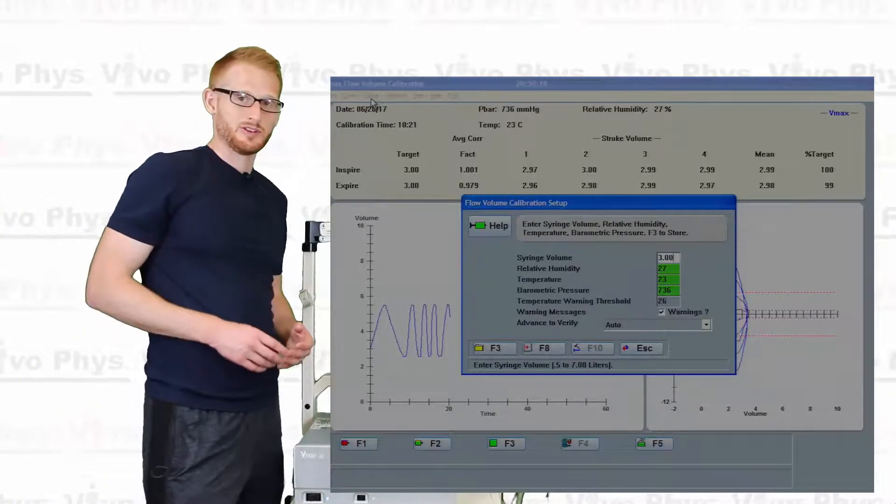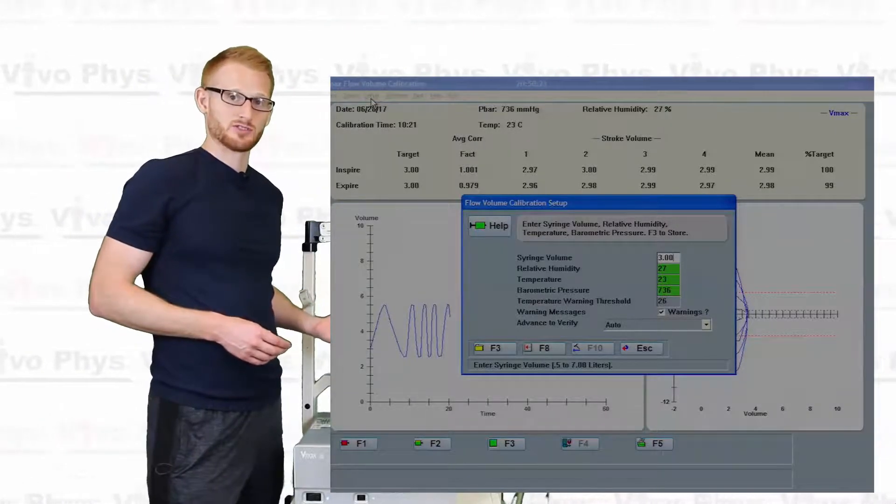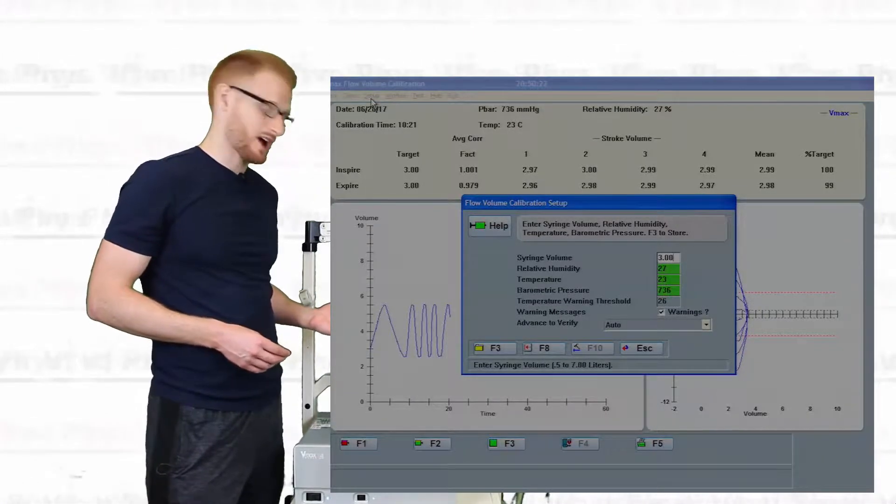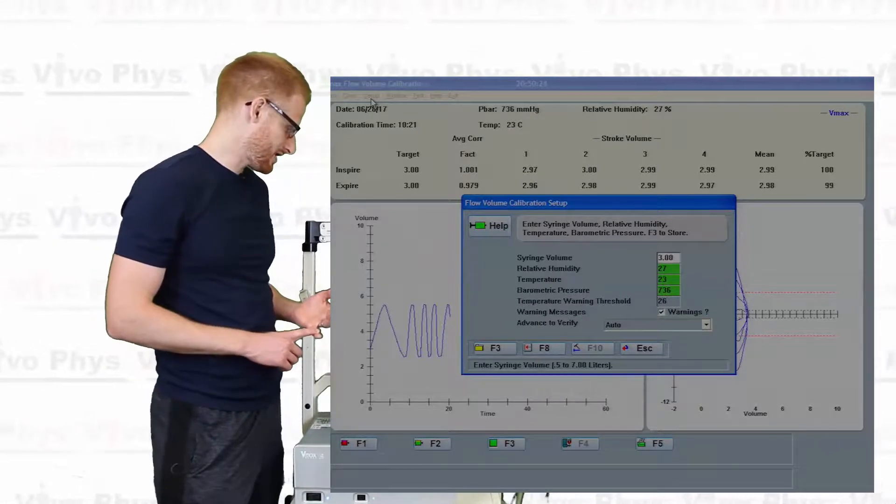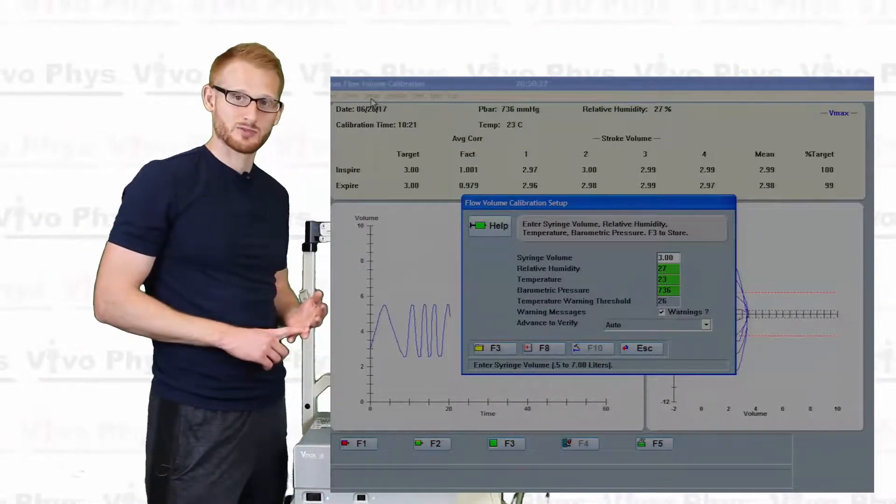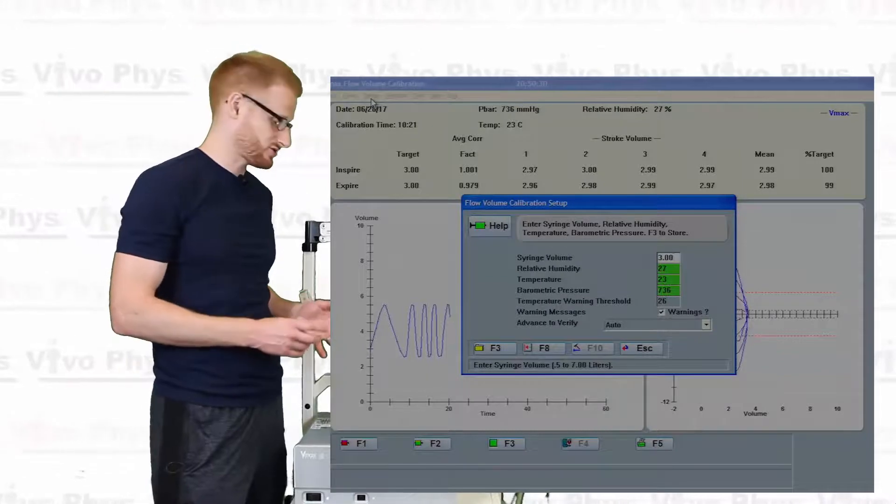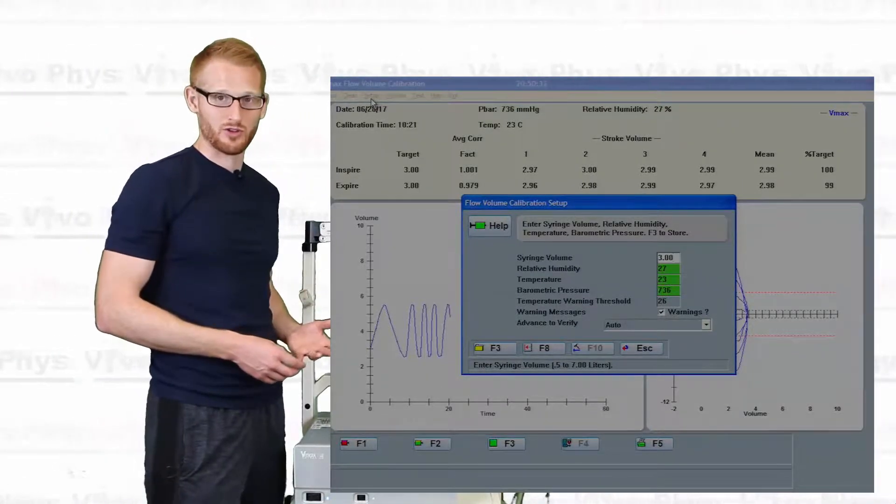And from the setup window, we can see the different parameters I was just talking about. So I've already set two of these. I've already done the temperature and the barometric pressure, but I'm going to go ahead and put in the humidity now so you can see how to do it. It's the same for all of those.